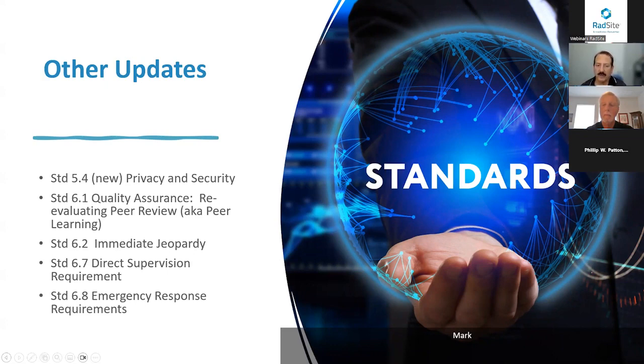And so, for me, what's really important is that each site develop its own process for making that determination, and that there's a loop of communication. I think it's important that the radiologists and even clinicians who are looking at the studies be able to provide feedback to the technologists, the chief technologists and the medical directors to help each site with its own process.